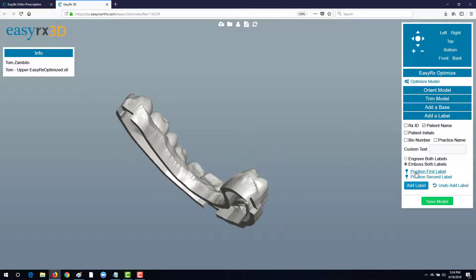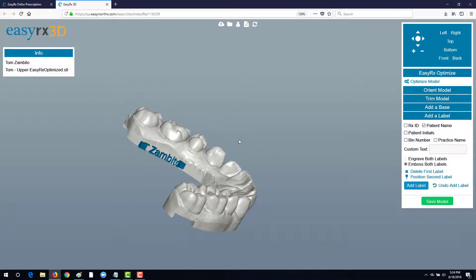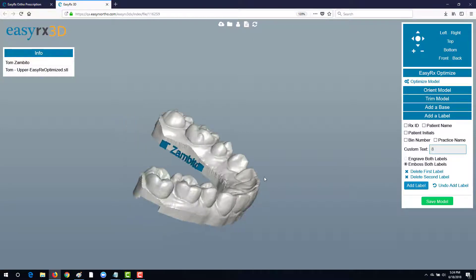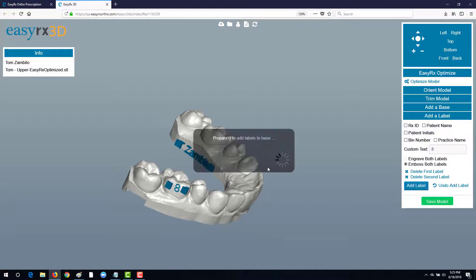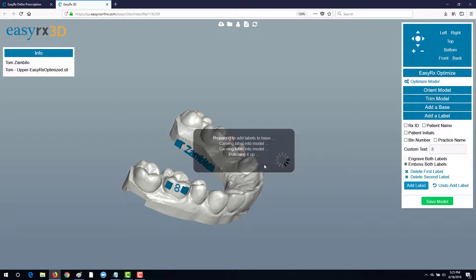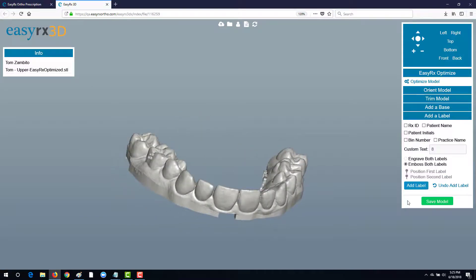We will select the patient's name and put our first label onto the side of the wall here and additionally we will do a second label for an aligner series number which we're going to place onto the buccal side of the tooth. We'll click add label and in a few seconds the labels have been added to our model. Pretty simple.